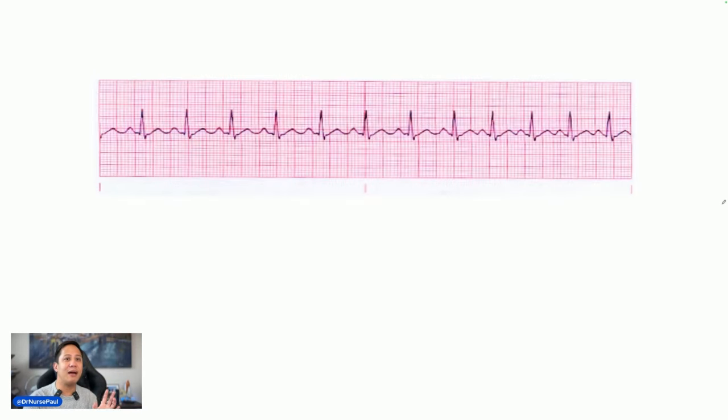It's hard to jump to EKG abnormalities when you don't even know the normal and physiology of EKGs. And I'm talking about lead two only. If you're only going to focus on one of the 12 leads, focus on lead two. Why? Because lead two follows the conduction system. It's in the same angle. To cut it short, don't overanalyze. Focus on lead two. Are we clear? Lead two will get you the best image. Everything that I'm showing you today is lead two.